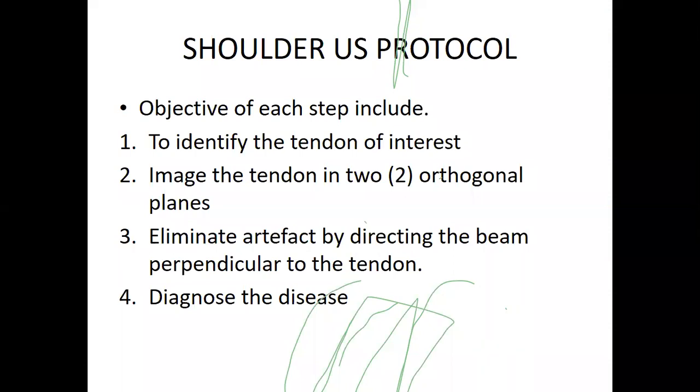You've got the superior, where you have to assess specific structures. You've got the anterior, lateral component. And lastly, you've got the posterior component. I'm going to discuss them well. So what is so important is to understand that we've got 4 components.